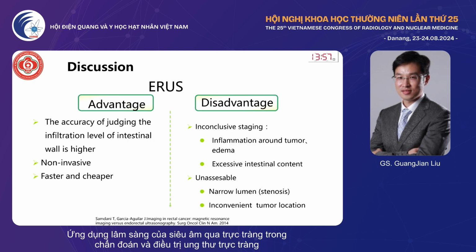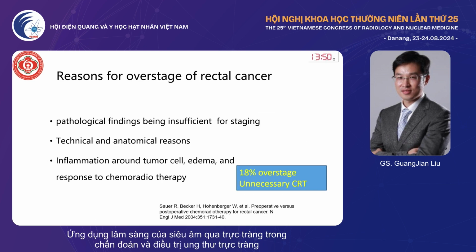We have some advantages, which are very high resolution, real-time observation, and being non-invasive. But we also have some limitations, because when the tumor is too high, we cannot reach it.